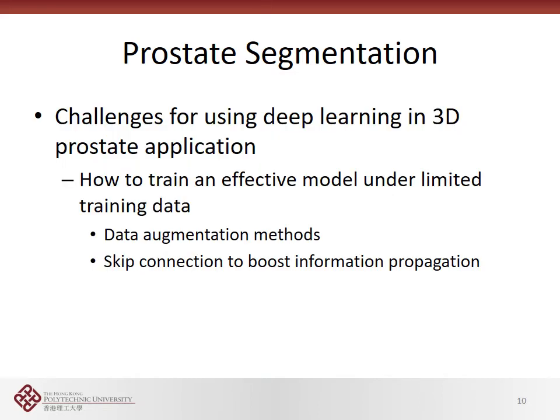There is another challenge for using deep learning in 3D prostate applications. Actually, one of the main challenges of using deep learning models for medical image processing applications is the limited training data, compared with natural image processing tasks. Because in natural image processing tasks, we usually can collect a large number of training data to train a model.